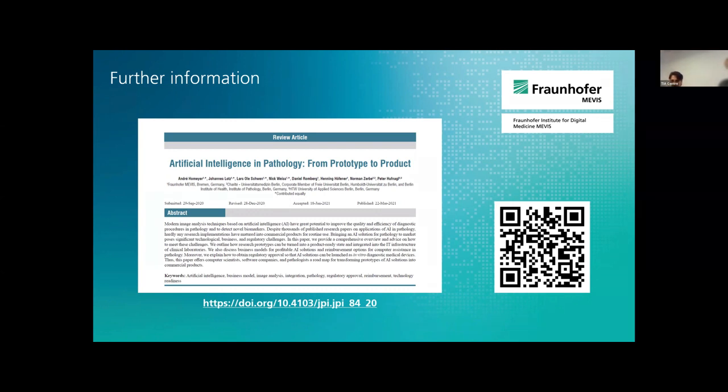What do you think? Yeah, I think this can definitely be helpful in assessing the practical value of a solution, but I think it's no replacement for having a really good, very comprehensive test data set from the real world. It's a good supplement, I would say, but you still need this other data set that really contains real cases from the real world with a very high variability in order to assess practical applicability.